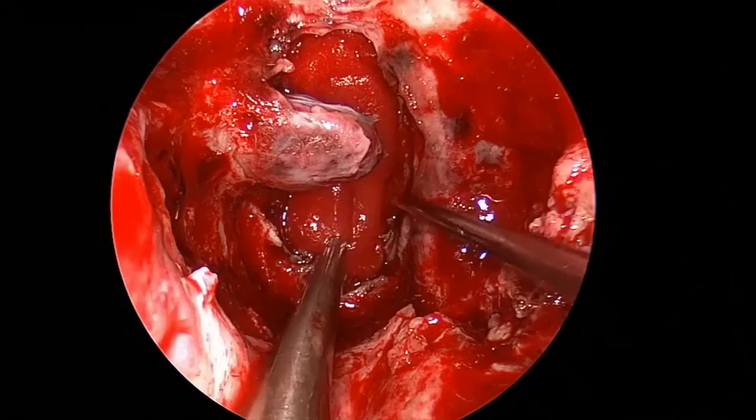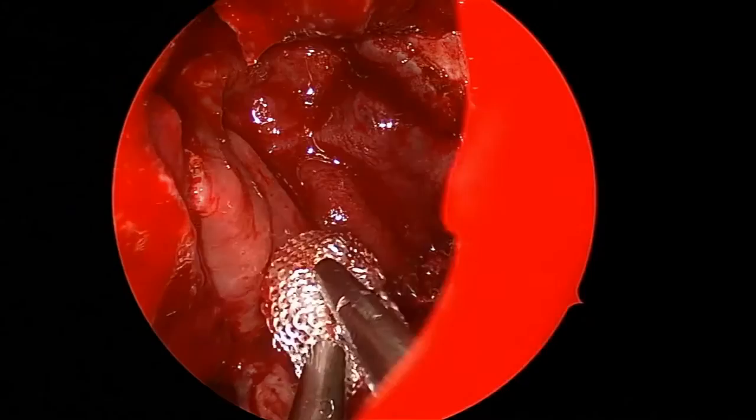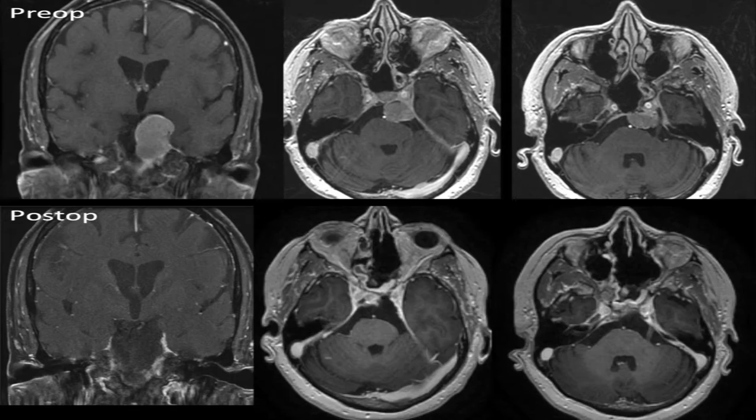Reconstruction with Duragen inlay. Now a fascia lata graft onlay. And now a vascularized nasoseptal flap being restored with Surgicel. And here is the post-op imaging showing complete resection of the tumor.